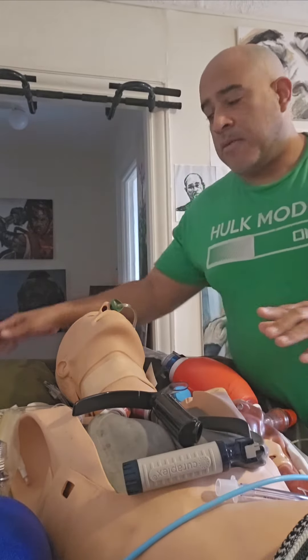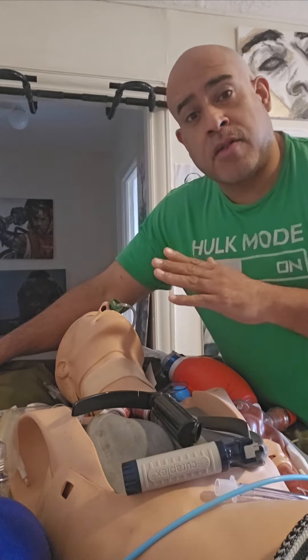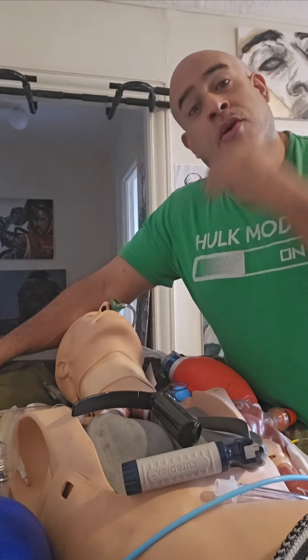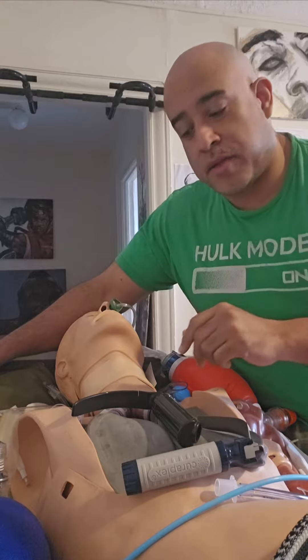I'm going to give you some advice. No matter what your attending tells you, your senior tells you — unless you practice with it in the mannequin, the cadaver, or in the OR, you'll never know what blade is the best blade for you unless you practice with it.